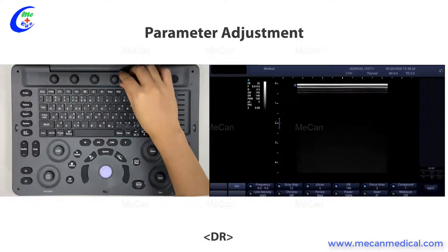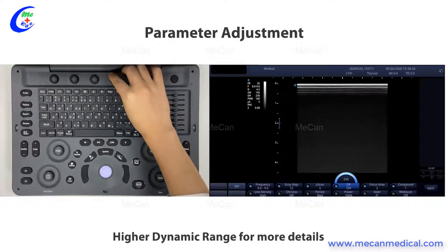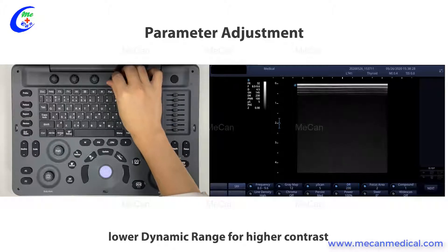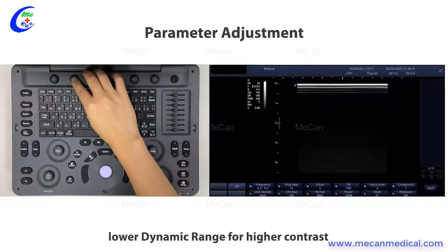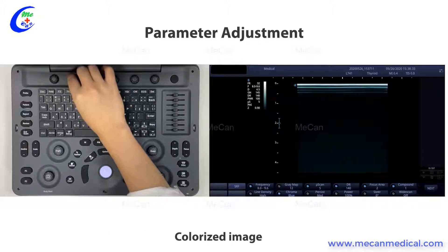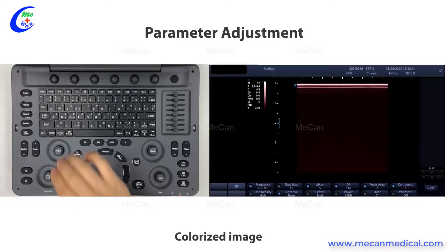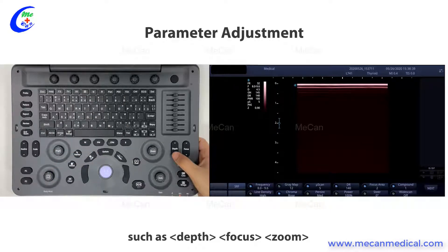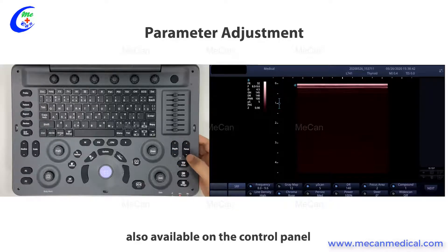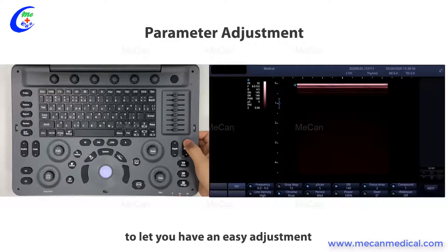Dynamic range: higher dynamic range for more details, lower dynamic range for higher contrast. Chroma: colorizes the image. Other frequently used parameter buttons such as depth, focus, and zoom are also available on the control panel to let you make easy adjustments.